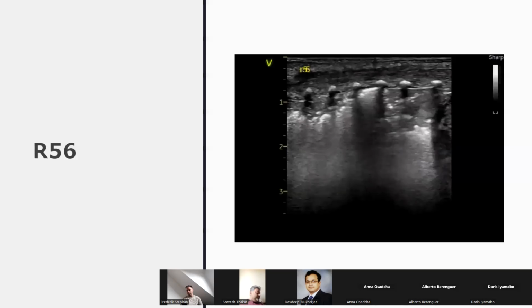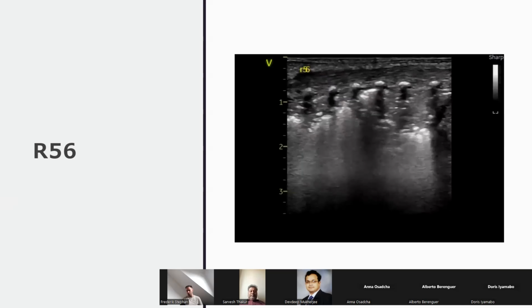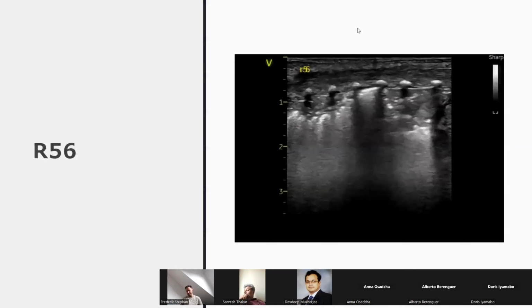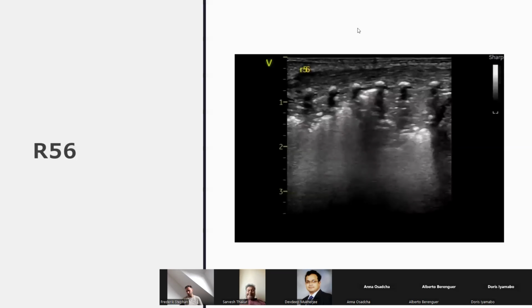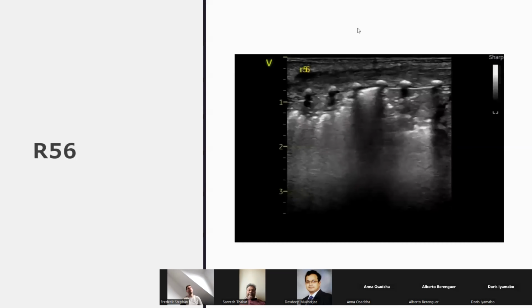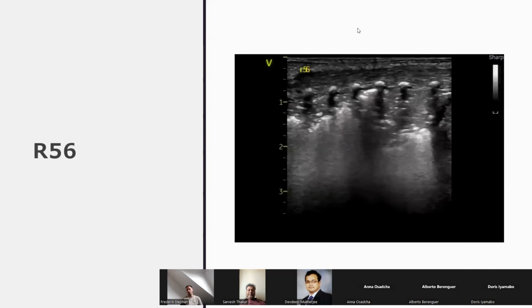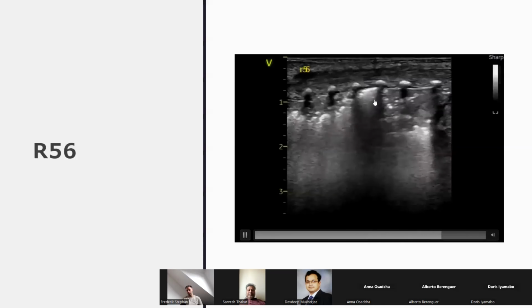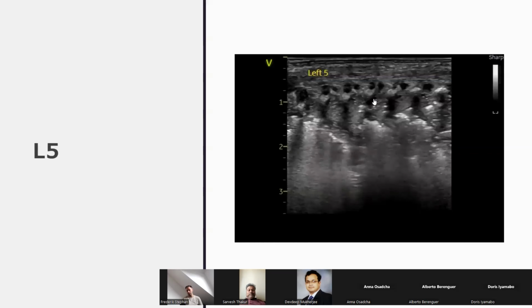So for the left side, we're going to get two other people now. So I want two more volunteers. So workshop guys. I can do a lot, Satish here. Satish is there. Praveen, are you happy giving Satish a hand? Yeah, sure, Alok.